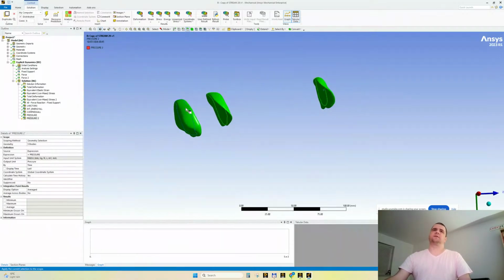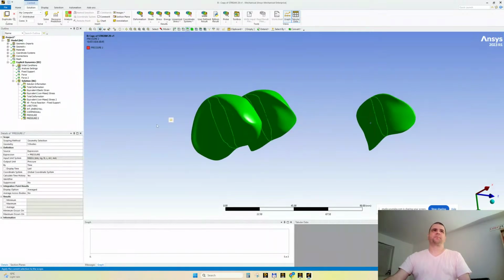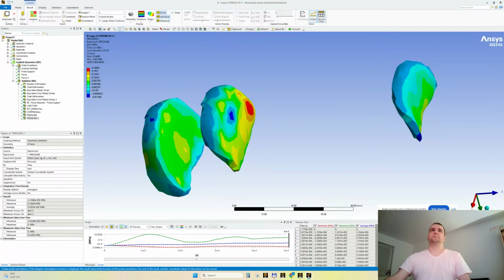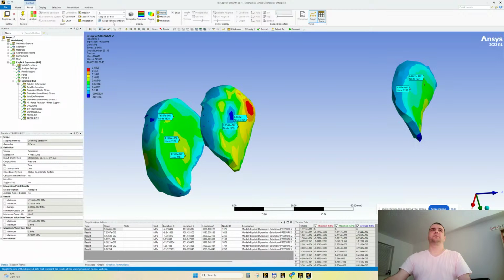Unfortunately we cannot discretize. I wanted to select this face only, but it's too big, too joined with the other faces. So let me show you the pressure, for example, in these faces, not solid, that's faces. A maximum of 0.16, but other values, 0.1, let's say we have something big here, 0.12.